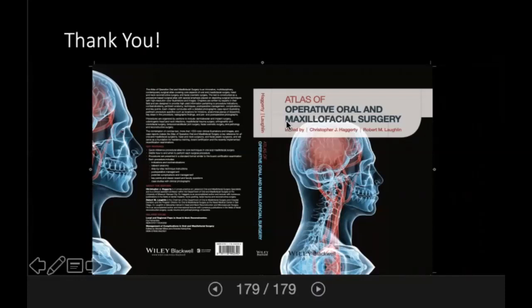That is right. There's a question here also from Dr. Chen that says, with a denture patient, put too much pressure on the implants when we place healing abutments immediately. And I think you've actually just had one of these slideshows showing that you usually just create a reservoir in the intaglio of the denture to avoid having too much pressure falling on the implants if you're going to be placing locator attachment healing abutments on them, right? That is absolutely correct. We will really want to take a large acrylic burr and core out those areas to minimize the pressure on it.